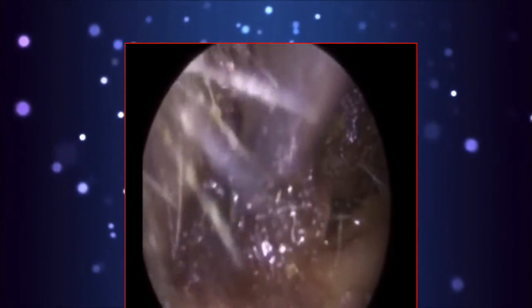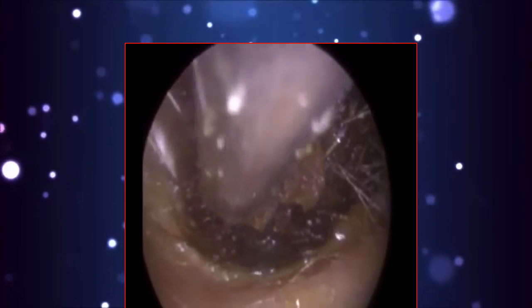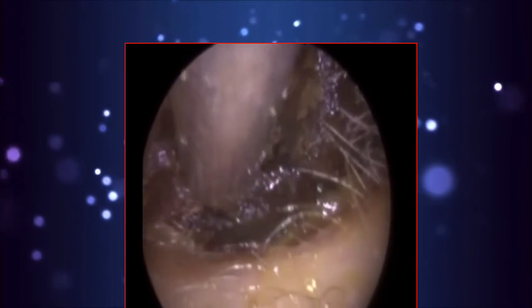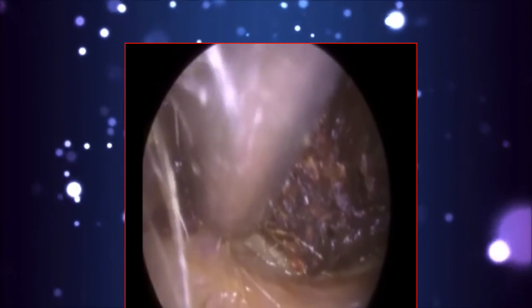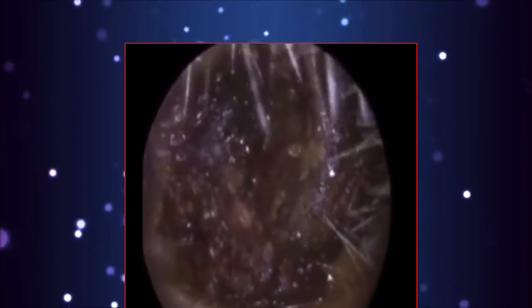So, well, I just shredded this bit, so I'm just trying to remove this. But you can see, even with the Zollner suction probe here, I've loosened this wax. It isn't coming. So in a moment, I was trying to avoid the ear hook again because he did find it slightly uncomfortable. So I went in with some forceps, but the forceps really weren't cutting the mustard either. So at the end of the procedure, I had no choice really but to put the ear hook in, and we did get the wax out in one big lump.